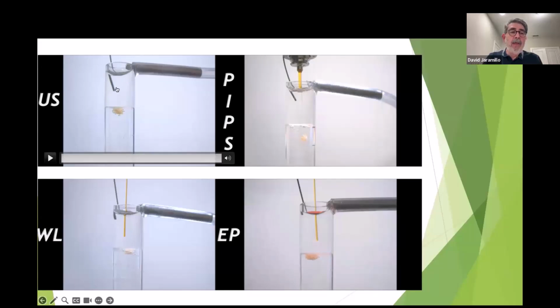And in the ultrasonic group, we didn't find any displacement 2 millimeters from the tip of the ultrasonic probe. So basically, there's only activity around the ultrasonic tip.